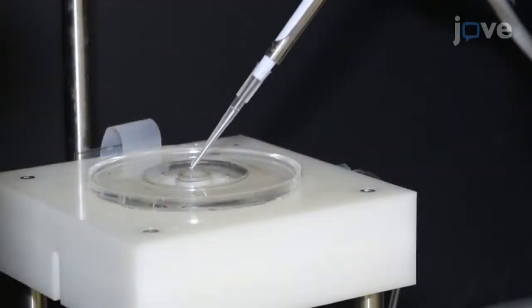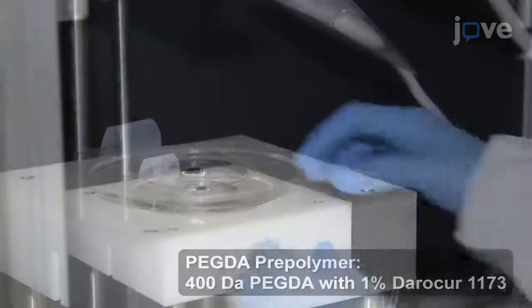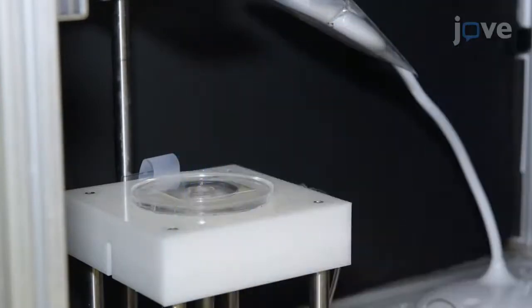Deposit a small volume of the PEG-DA prepolymer sufficient to cover the bottom substrate and then place the top substrate onto the PDMS chamber. It is important to ensure that there are no air bubbles trapped between the top and bottom substrates. Air bubbles will result in large pores or defects forming in the polymerized hydrogel.